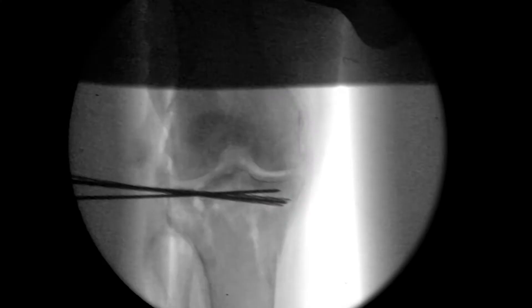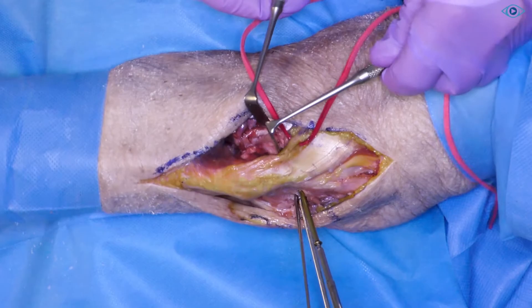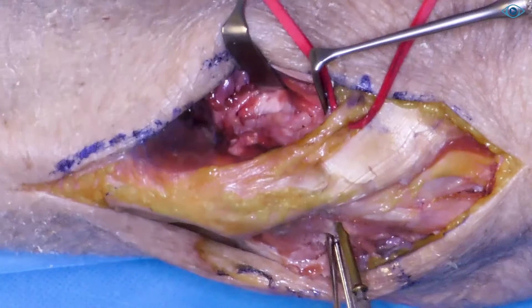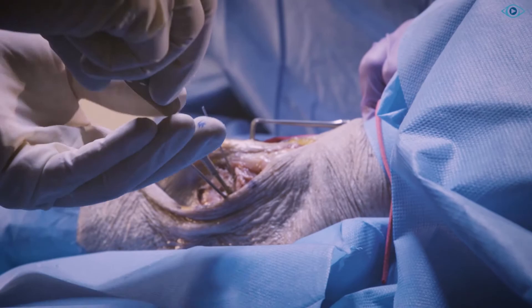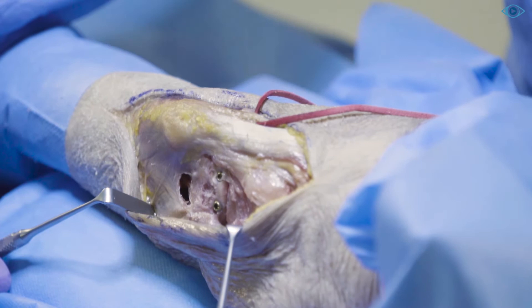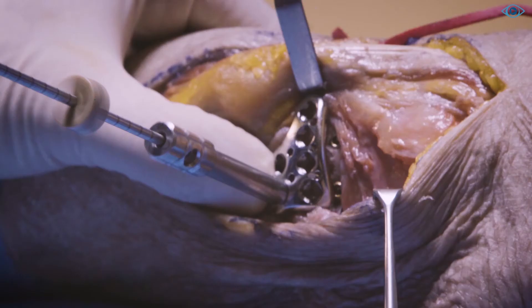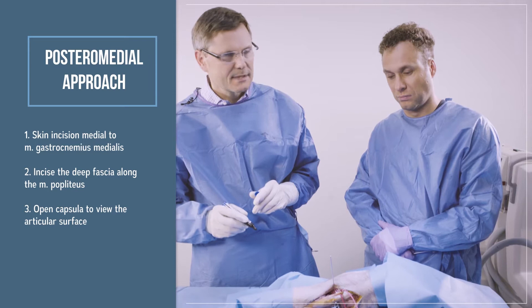We have repositioned the tibial head now and roughly fixed it with K wires. Now we are going to use two cannulated screws to pull together the slightly too wide tibial head. With this screw, we particularly fix the posterolateral segments. It's important not to choose this front screw too long, because we have to lift up the anterior medial fragment, which we could easily block with this screw. The tibial head is very soft, so we really have to place these screws directly under the joint surface, otherwise they won't hold. Here is the iliotibial tract. Now we apply the plate from the lateral — the patient remains in prone position. We use a very long plate because the fracture runs relatively far distal. Now we have reduced the lateral side and adjusted the joint surface, so it's time to take care of the medial side.